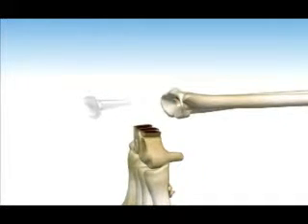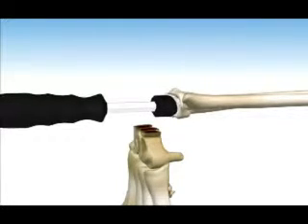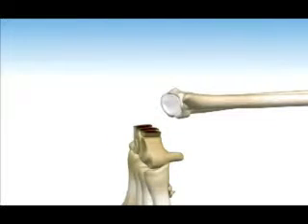Insert the radial trial into the prepared canal and impact the trial until seated. Evaluate the fit of the component against the scaphoid and lunate fossa as well as the dorsal peripheral ridge. The implant should fit snug or flush against the dorsal ridge of the distal radius. If the fit is satisfactory, remove the trial component by engaging the extraction holes with a Gelpi retractor. If the trial is proud, further broaching or selective burring of the distal radius is needed.